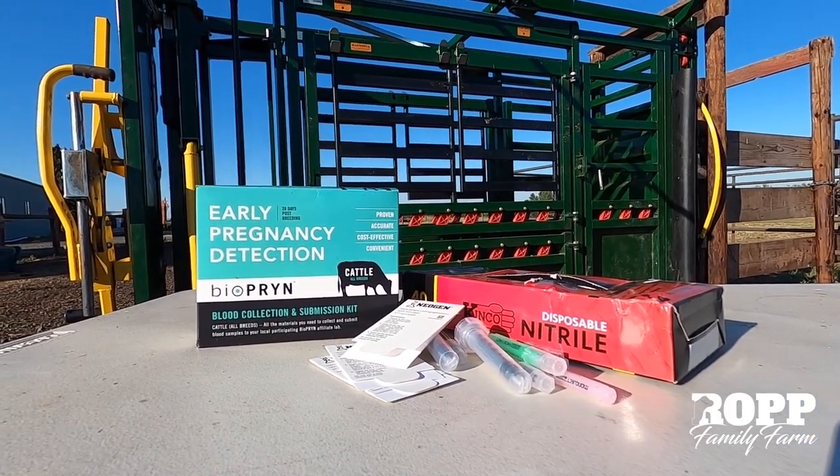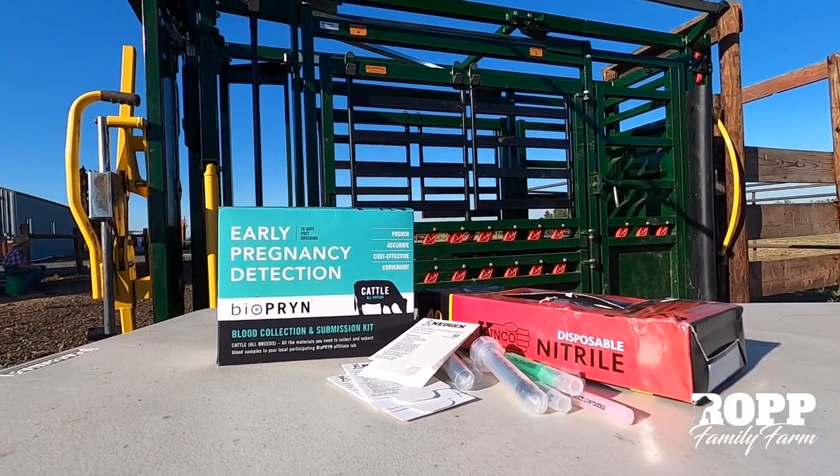We're out here with the cows. We're going to be drawing some blood on the cows today for a couple of reasons. One, we're going to be drawing blood to confirm pregnancy using the BioPRYN pregnancy test, and two, we're going to be using some of that blood for genetic genome EPDs. So we're going to kill two birds with one stone this morning. We started out early because it's hot, so let's get this done and get inside where it's nice and cool.